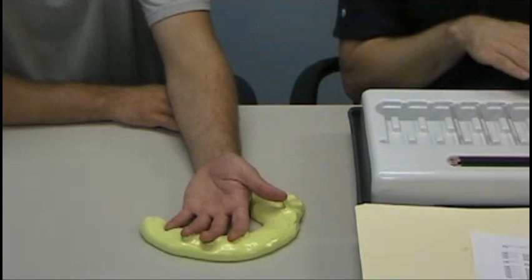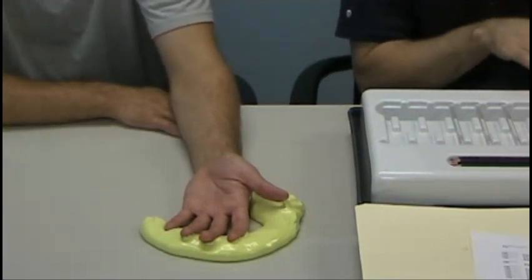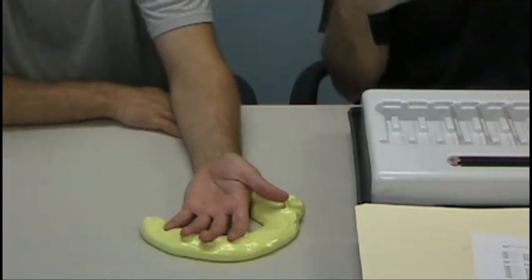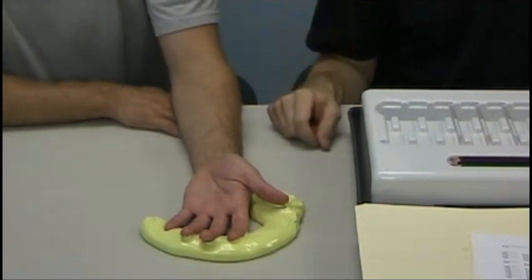You apply the filaments from smallest to largest. As soon as they feel, for example, the smallest filament, that part you're testing is done. You don't have to test anything larger after that for that particular region.